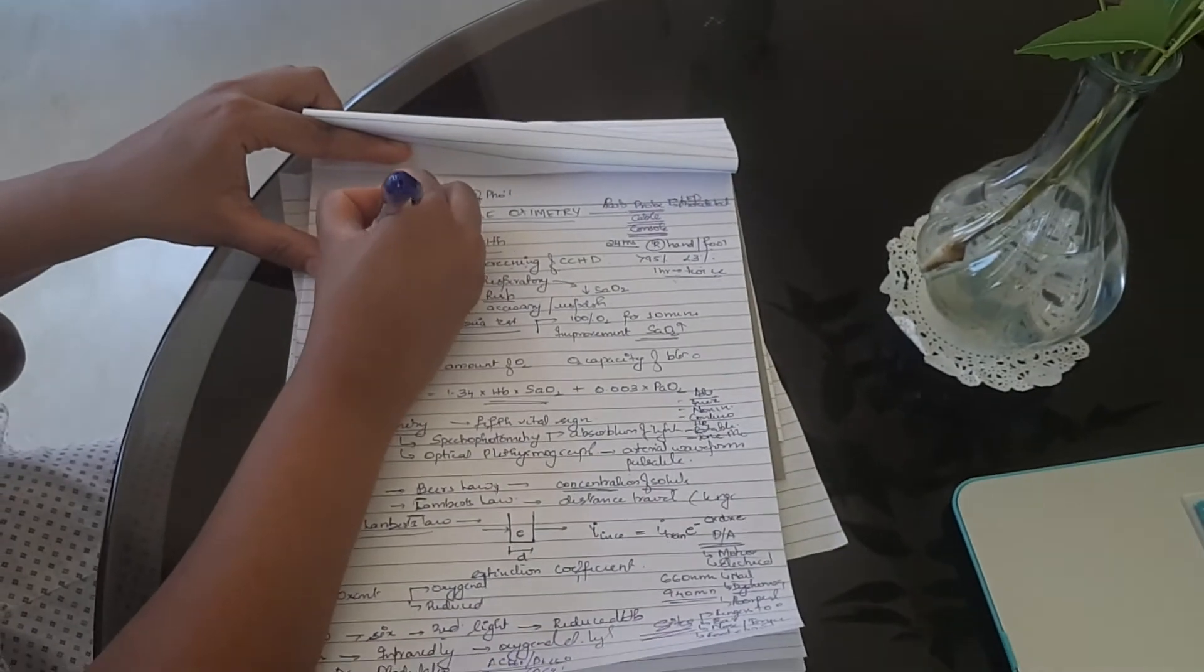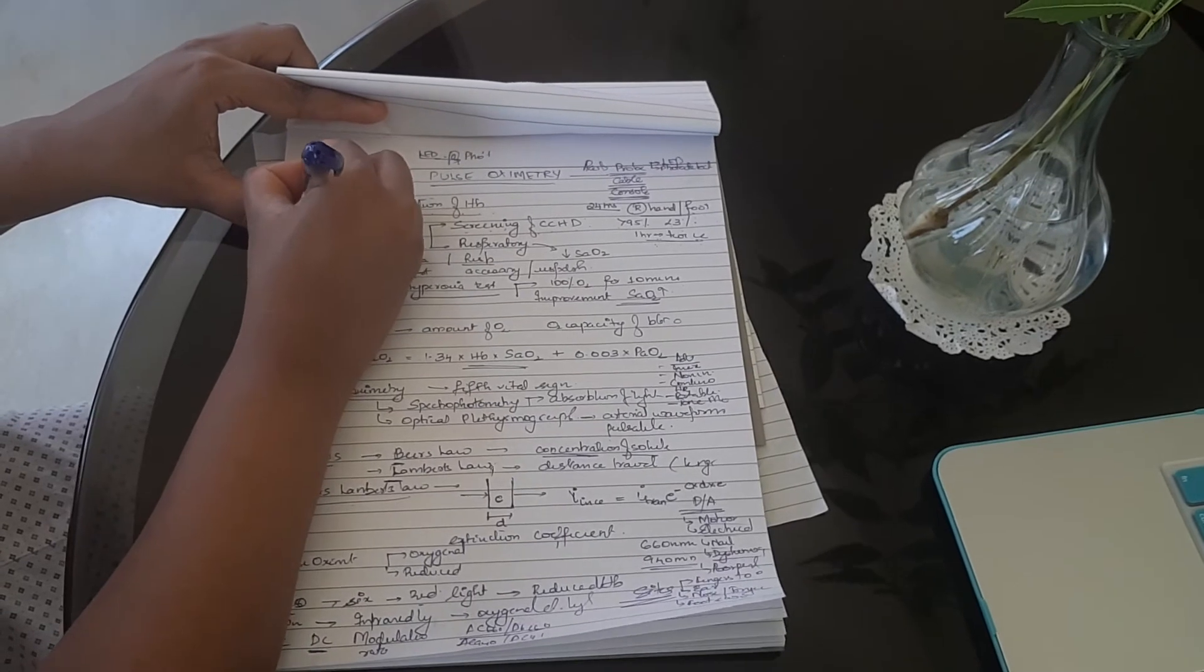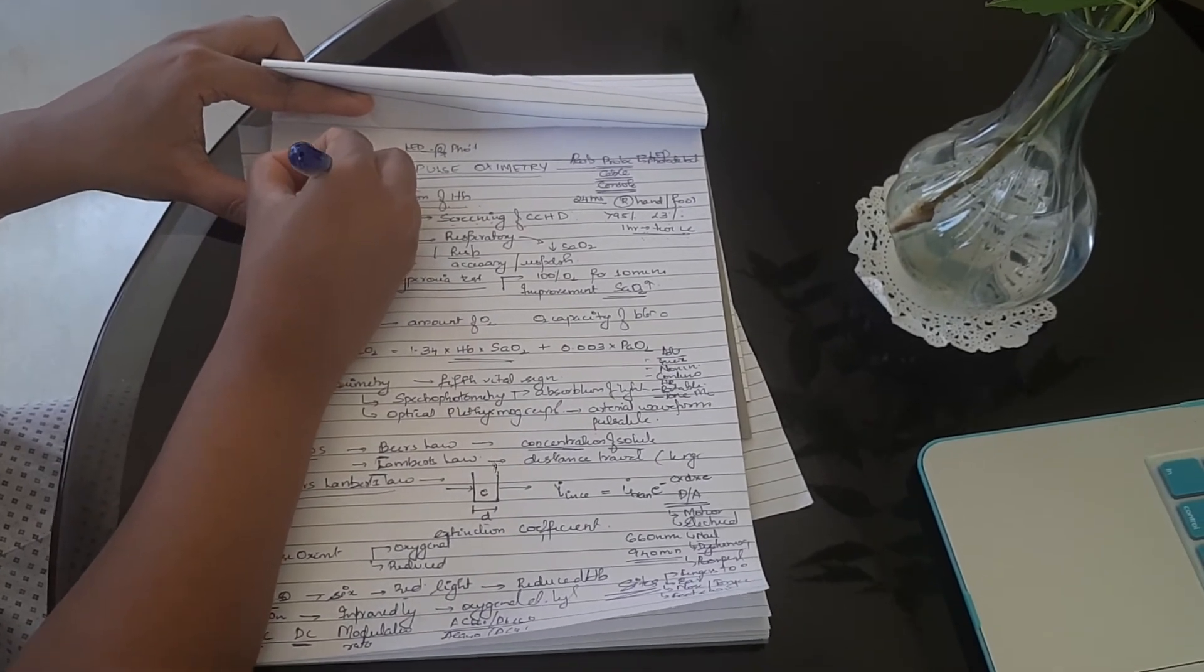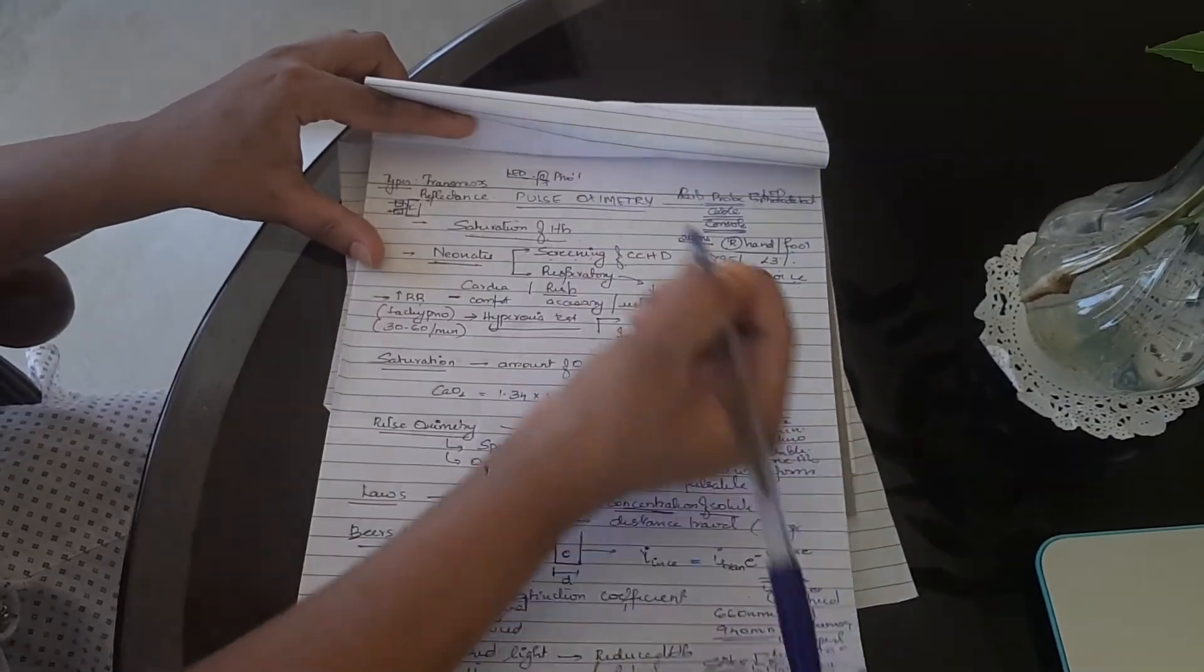The other one is reflectance pulse oximetry. In reflectance pulse oximetry, the light emitting diode and photodetector are on the same side. Say you put it on the forehead - this is the forehead - the light is transmitted, the reflected light is detected.